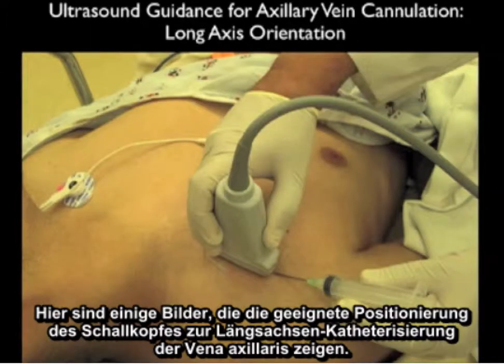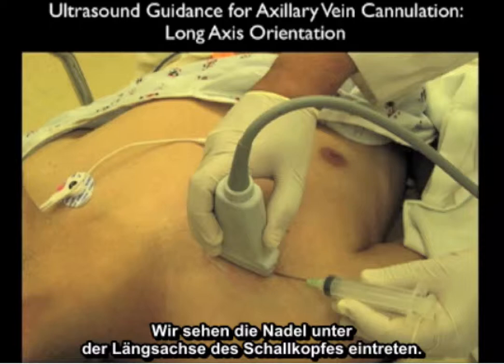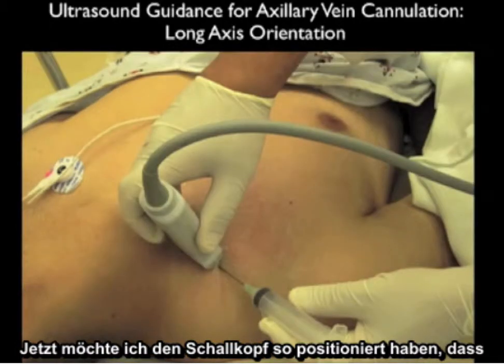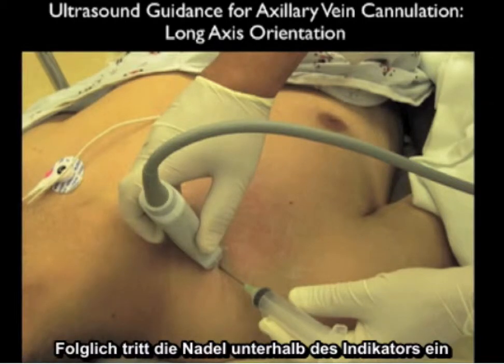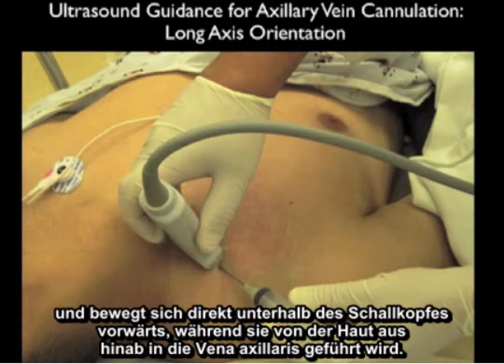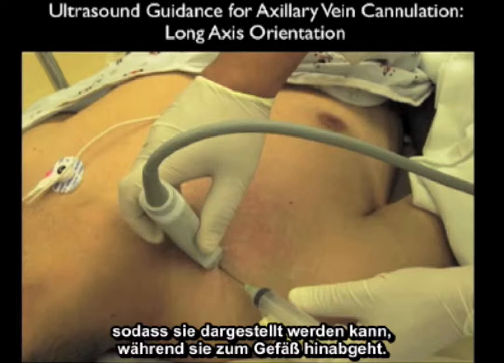Here are images showing the appropriate probe positioning for long axis cannulation of the axillary vein. We have the high frequency linear array probe positioned over the lateral chest wall directly over the axillary vein, with the needle coming in under the long axis of the probe. The probe marker is oriented lateral so the needle comes in underneath the indicator and progresses directly under the probe from skin to axillary vein. It is important to keep the needle in-plane underneath the probe at all times so it can be visualized as it approaches the vessel.